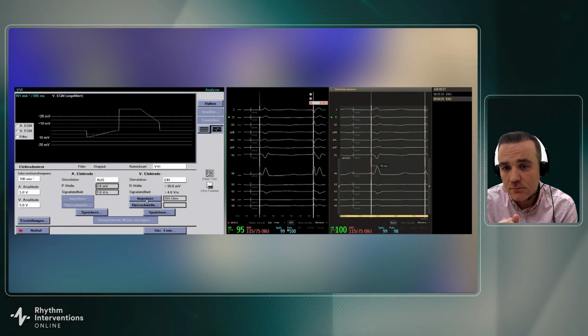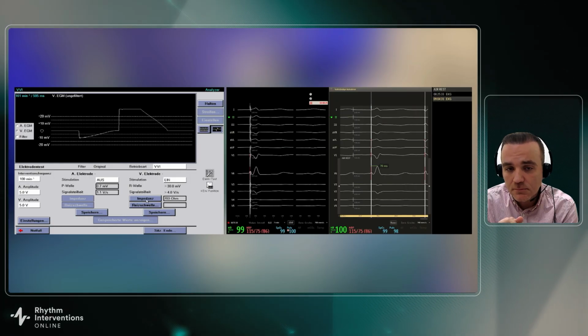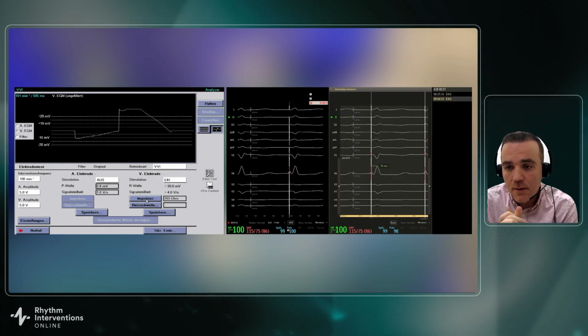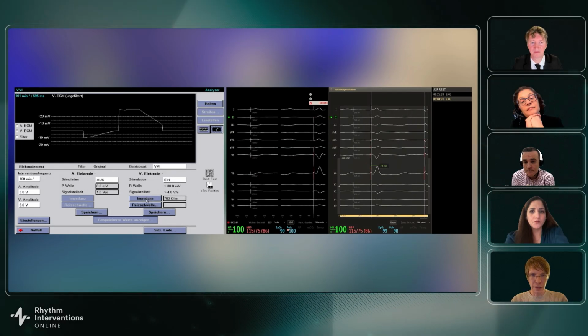What output was that? 5 volt. Okay. So then, one question. Yep. Do you have any additional?